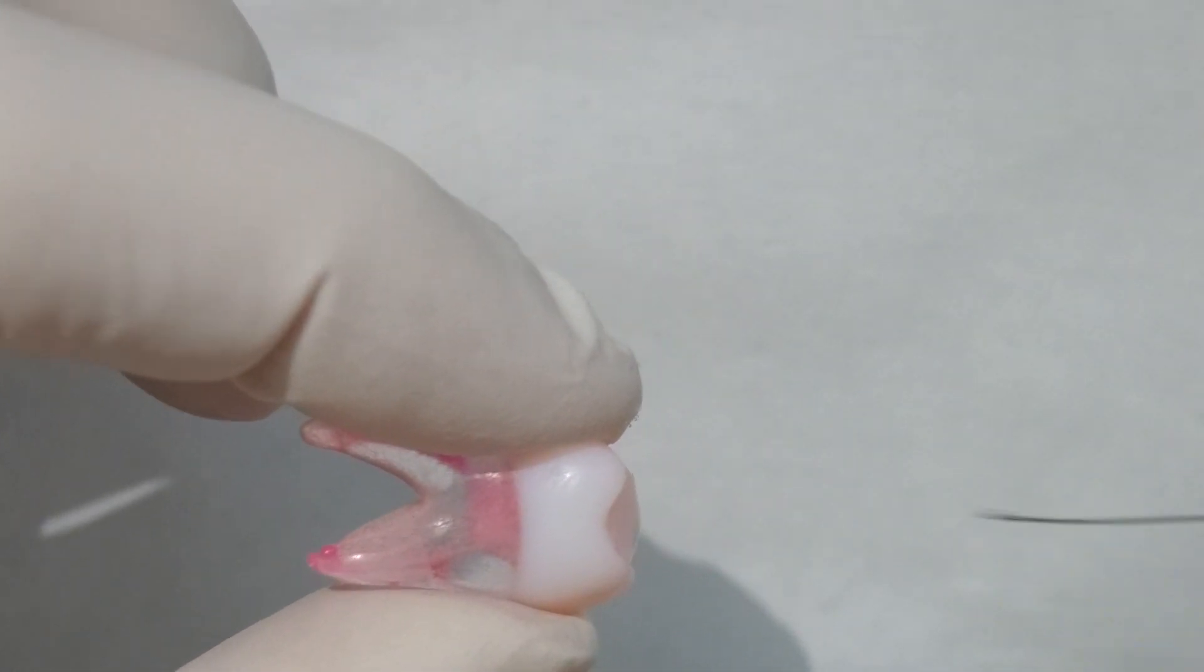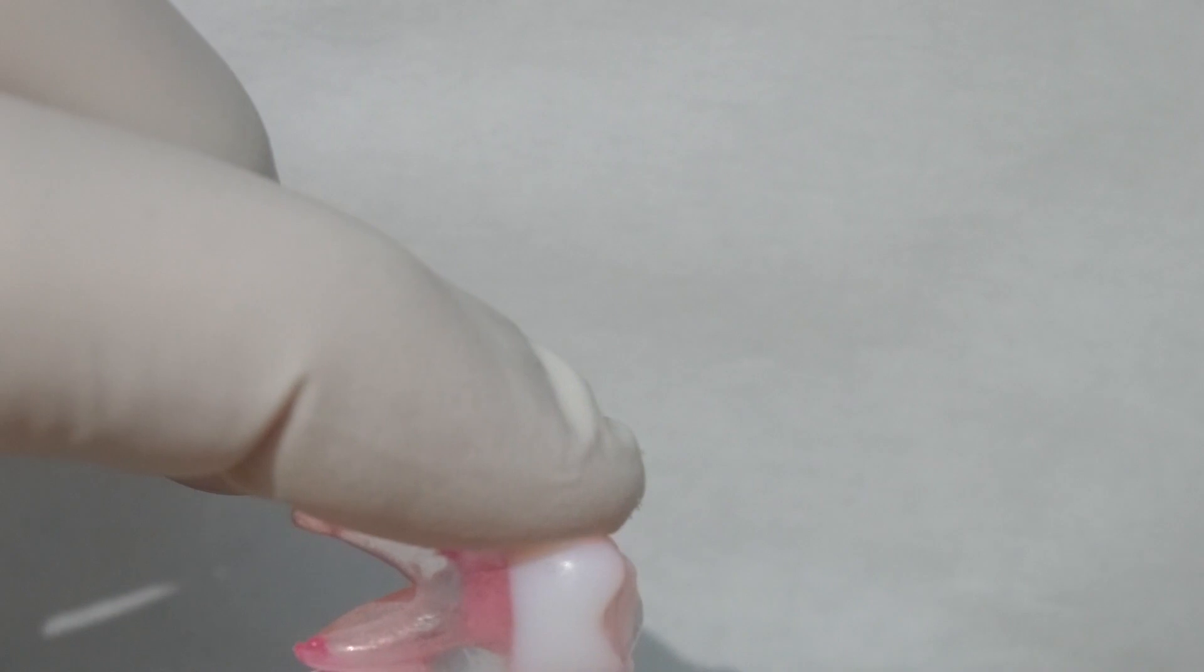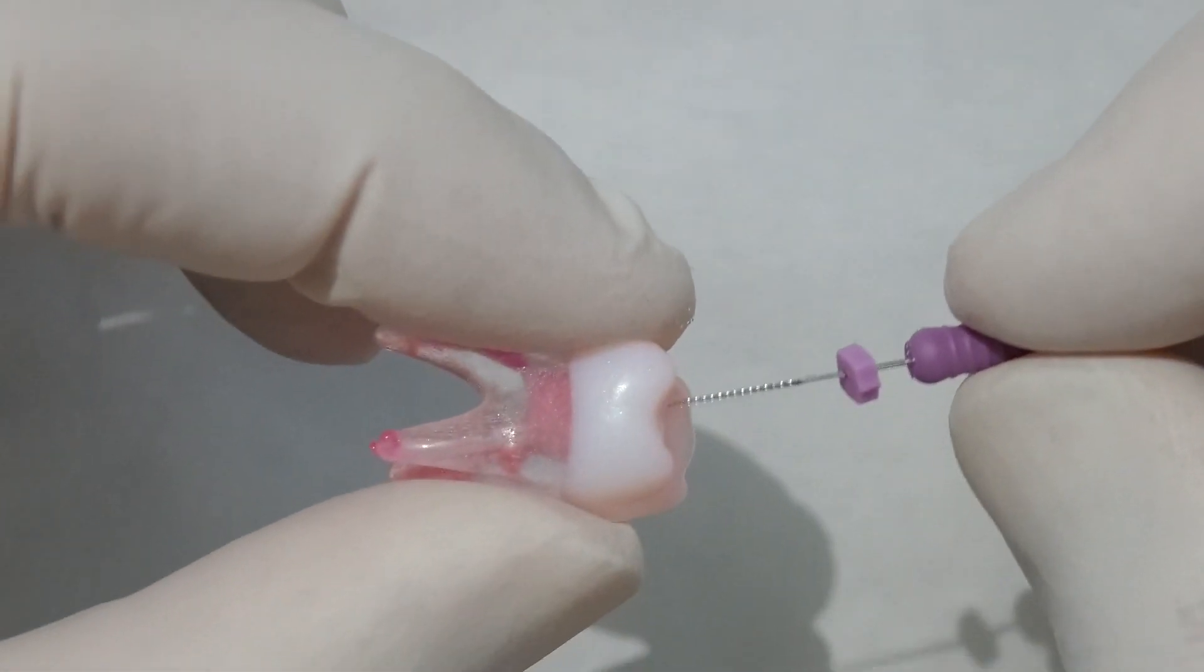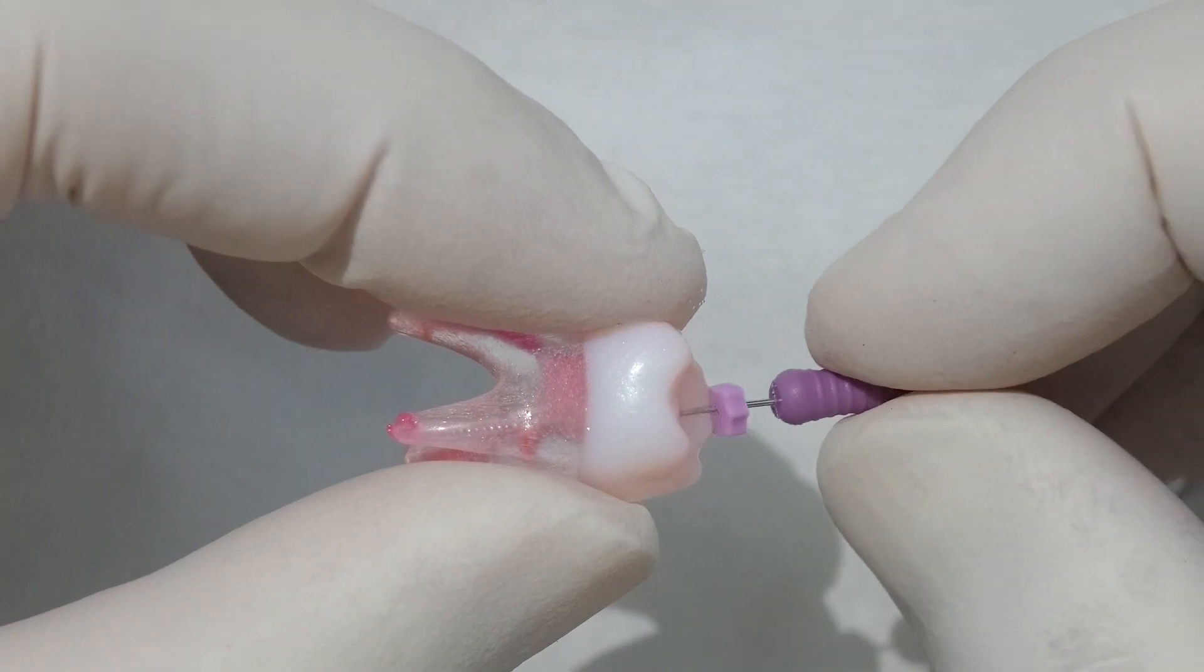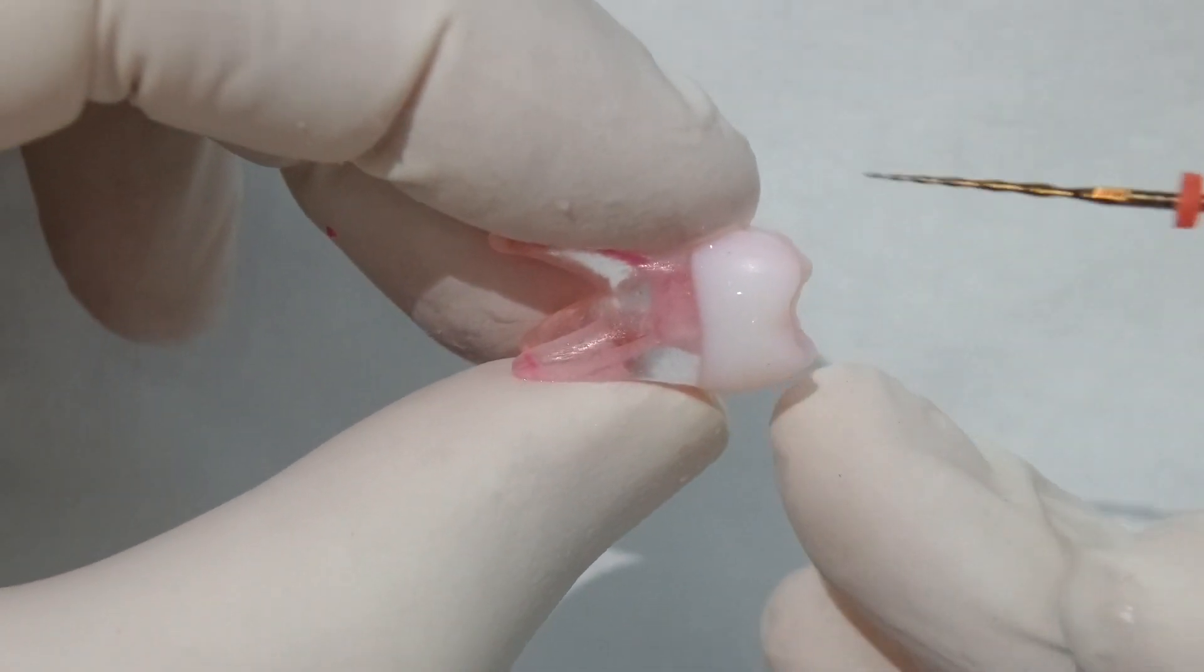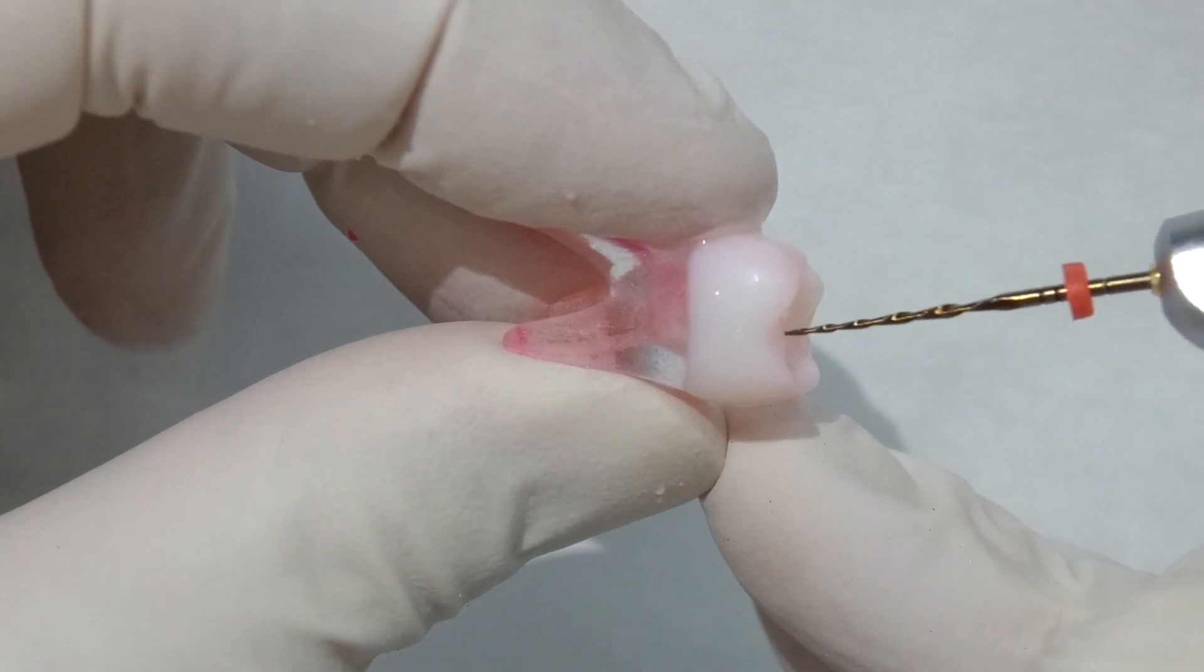But we're just going to irrigate. We don't leave that file in there for too long, because it can create loads of debris. So we irrigate. We make sure it's patent again. Get that size 10. Again, measure to that zero point. Just bounce that in there. Make sure not much resistance to that now, because we've done a nice bit of shaping already.